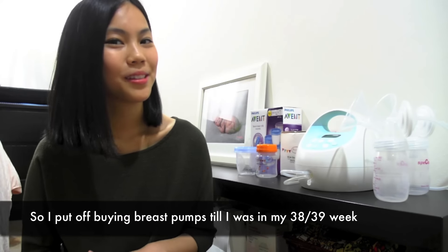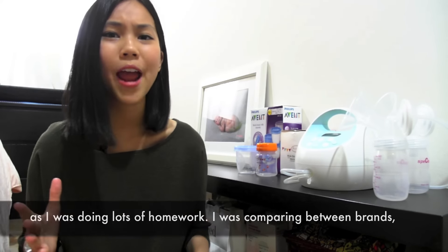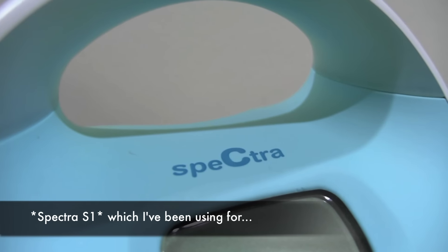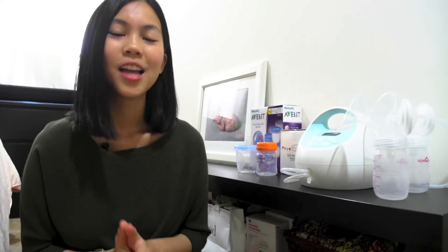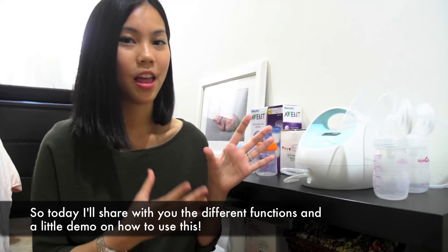I put off buying breast pumps till I was in my 38th or 39th week as I was doing lots of homework — I was comparing between brands and between different functions. I chanced upon the Spectra S1, which I've been using for close to 4 months now, and I love it a lot. Today I'll share with you the different functions and a little demo on how to use this.